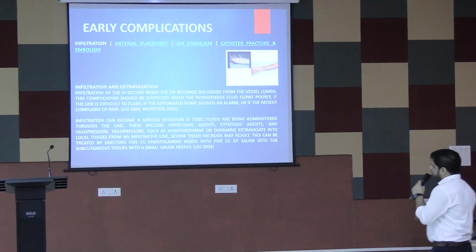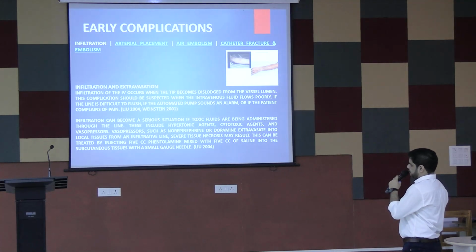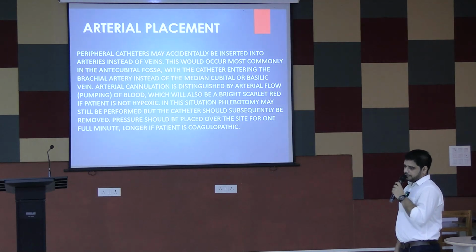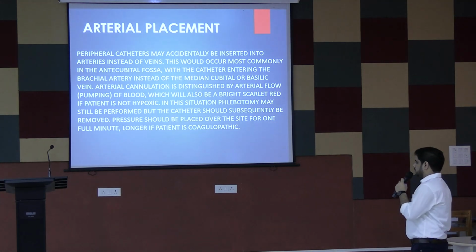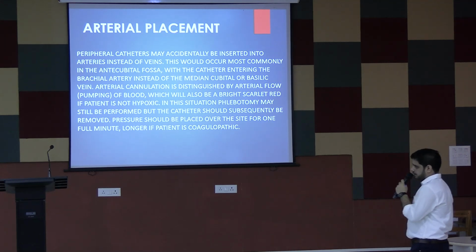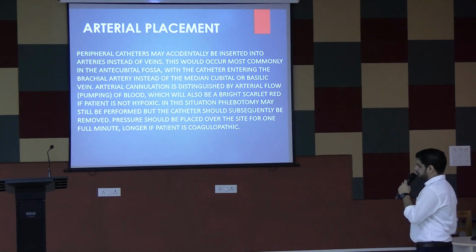Early complications: arterial placement, air embolism, catheter fracture, and embolism. Arterial placement sometimes happens because in some patients the artery is so superficial that we cannot differentiate the vein and artery. So arterial introduction of the cannula is much more common.